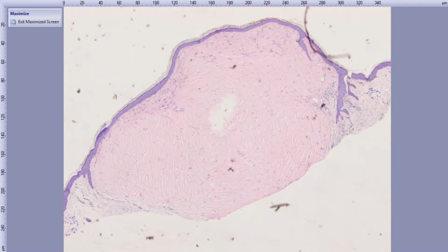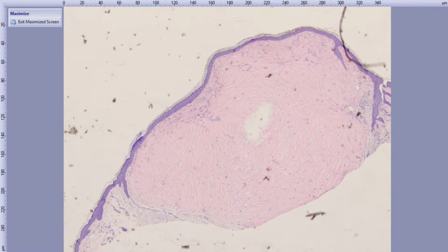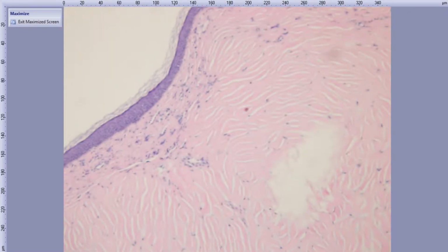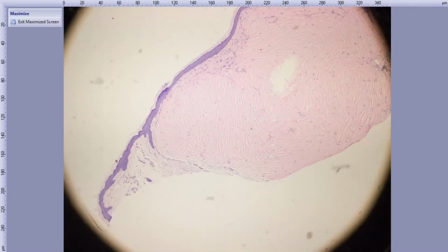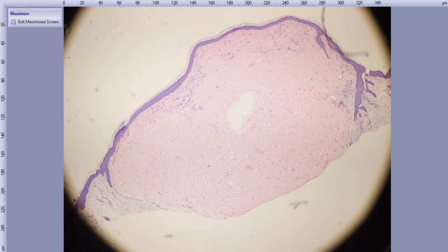What genetic issue, what gene could this patient have an issue with? PTEN. PTEN, all right, good. Board exam question. Yeah, so this is a circumscribed storiform collagenoma. That's one name for it.